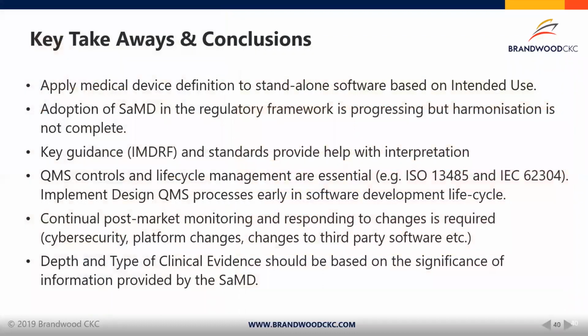So some of the key takeaways and conclusions of this presentation, before we move to questions. Obviously the key differentiation between lifestyle software and a medical device is simply by comparing the intended use of the device with the medical device definition as it stands in the regulation. So this is really based on the intended use, feature sets, etc.